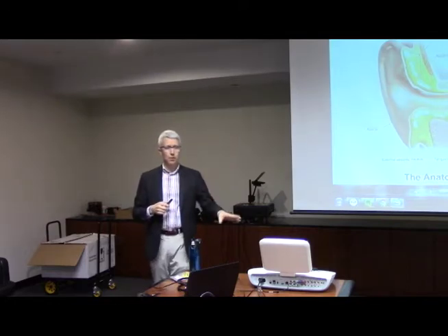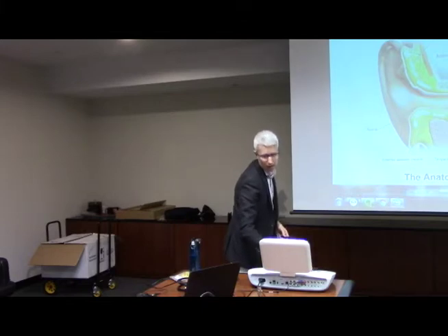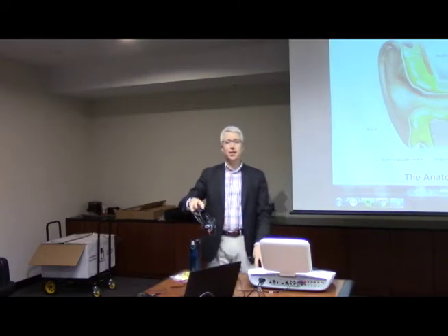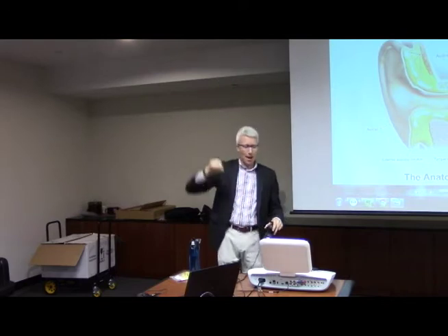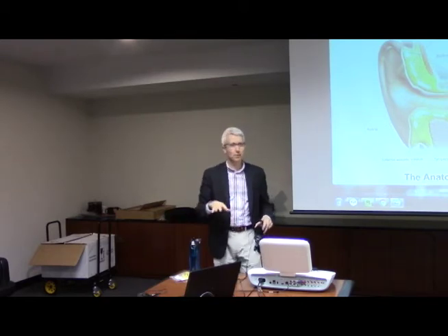So most clinical audiometers that are sold today have word lists built in. So if I were to go over to speech and make this so it's audible to you all. Which one are you using? This is the GSI Audio Star, which I haven't said because I'm not in the position that I can really lift it and hold it up to you. But I will, thank you for asking and mentioning that. And I've got another one I'm going to show you here in a second, kind of comparing and contrasting. But at the end, you're welcome to come up and take a look.